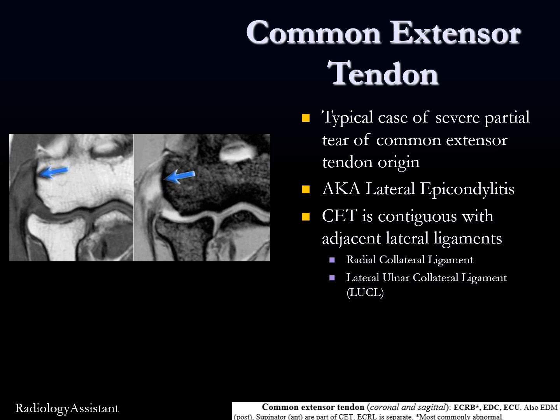Here's a typical case of severe partial tear of the common extensor tendon origin, also known as lateral epicondylitis or tennis elbow. One important note is that the common extensor tendon can be contiguous with the adjacent lateral ligaments — the radial collateral ligament and the LUCL. So at the deep margin of the tendon, there are the lateral capsular ligaments of the elbow, and these abnormalities can go together.